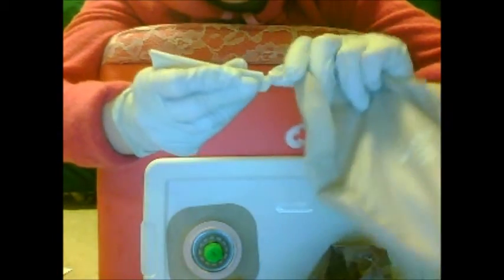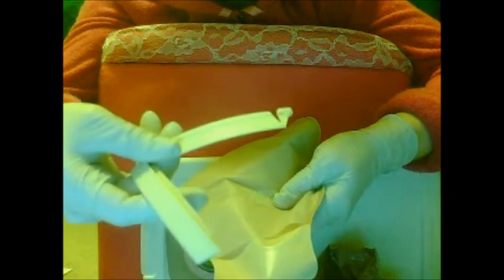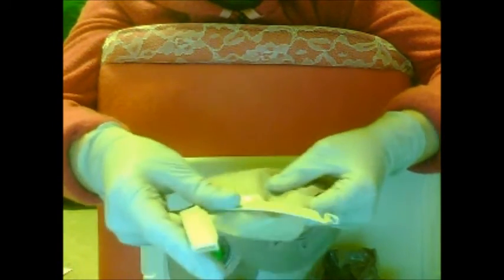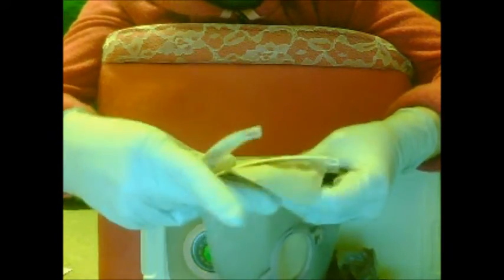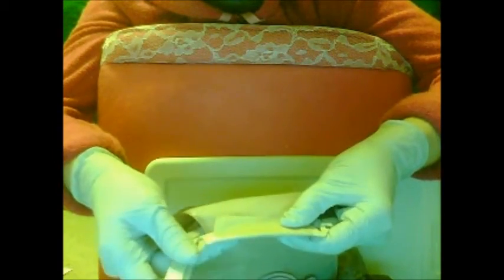It just snaps open and closed. Then you just hold it and whip that thing on. Make sure there's kind of equal distance from each side, so that you don't have leakage or spillage.